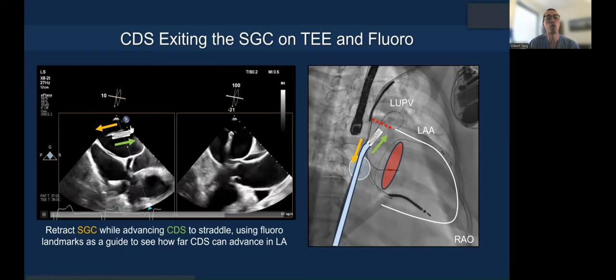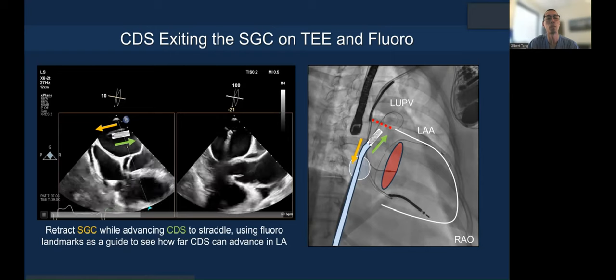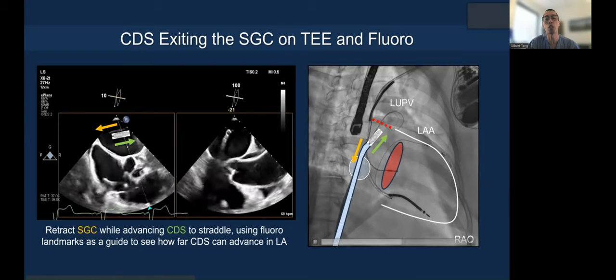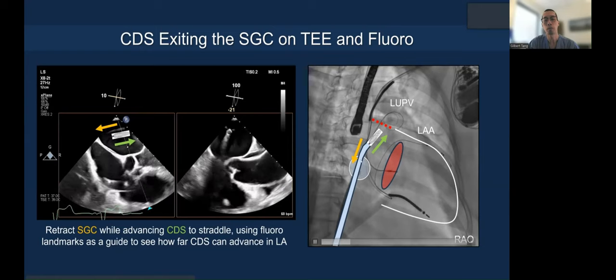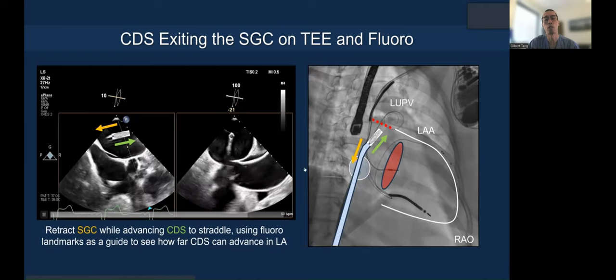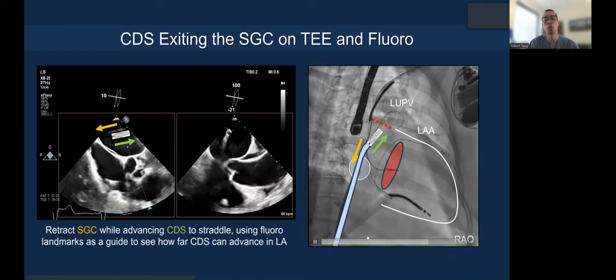We use two views to place the cursor on the tip of the guide to know exactly where you are. In the fluoroscopic image, as the clip exits the guide, you retract it backward — as shown on fluoroscopy — so you can perform your straddle.